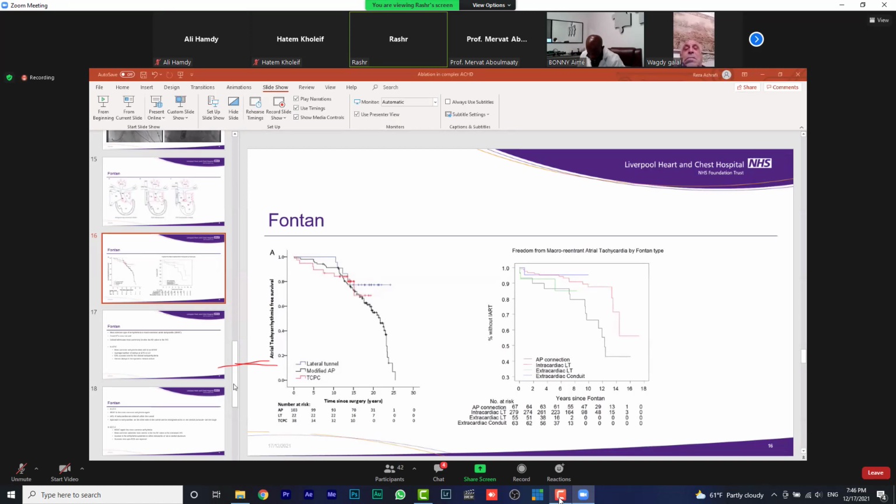Certainly, I've asked for help from them for quite a few cases, especially in pacing, when I've done a conduit puncture and I've asked them to snare the needle so I can pull through from the top. I think it can be very useful sometimes. I guess the other thing they're quite good with is intracardiac echo, which can sometimes help you. And I think in these most complex cases, sometimes having a second pair of hands or someone to help with the bits that maybe you're not as good at, can be invaluable.